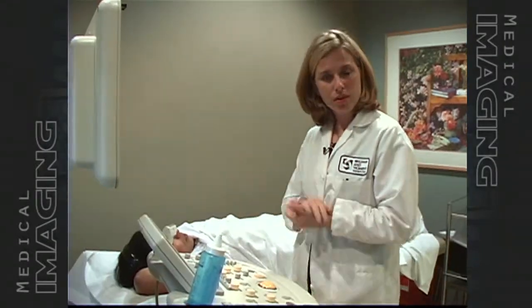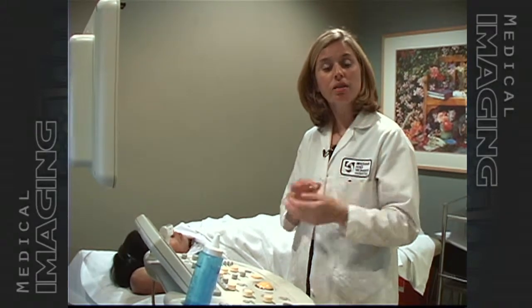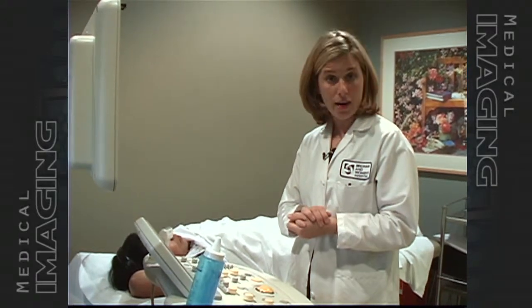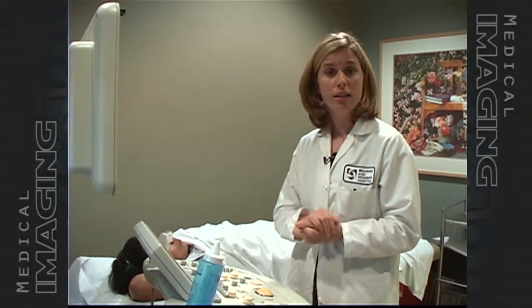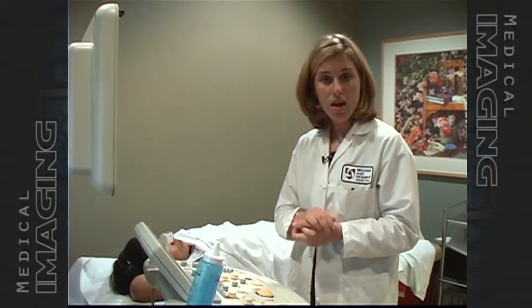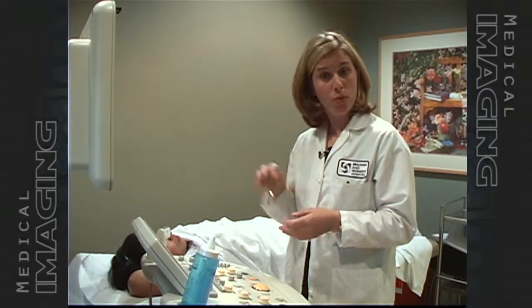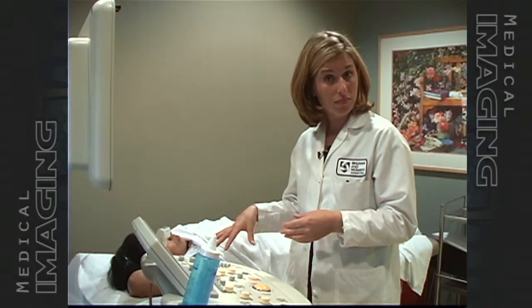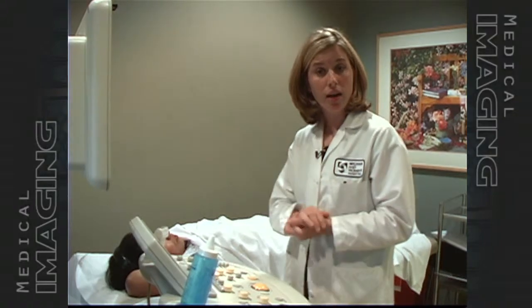Patients with this sort of finding end up getting scheduled for a biopsy. They'll return to the department at a different time for the biopsy, and the biopsy will be performed right here in the ultrasound room under ultrasound guidance.